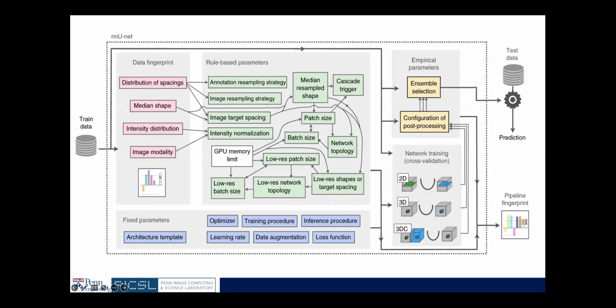Okay. So as I said, it's a package. The package takes care of everything, right from pre-processing the data, setting up the different loss functions, the different architectural choices, and then finally it gives a nice prediction. Right?